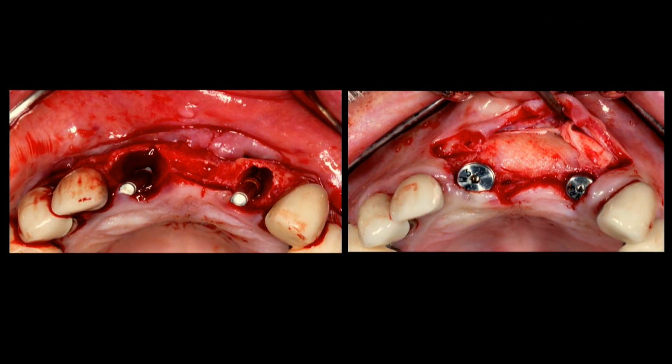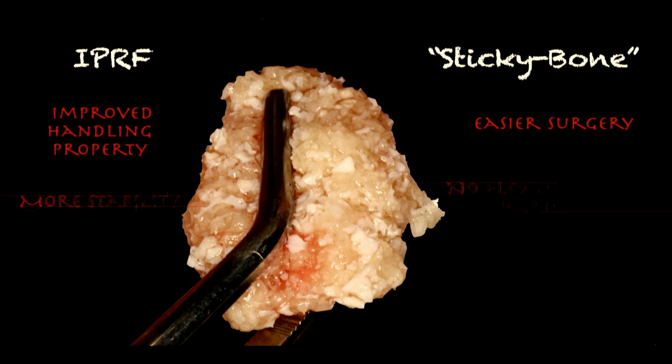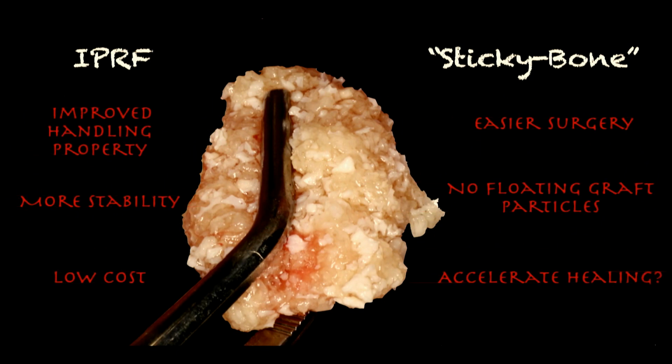So it's not to say that we need a collagen membrane here, but I did use one, again, to help grow bone outside the housing. I feel like we did really well here, and I definitely owe that to the fact that we also used that Amnion-Chorion. And again, using some shreds of the Amnion-Chorion mixed with the bone graft is never a bad thing. It adds some growth factors here. Not to say that you can't do this without a collagen membrane, as John will show you.